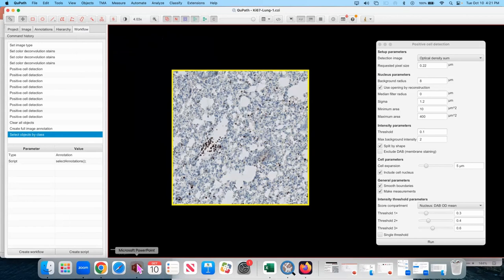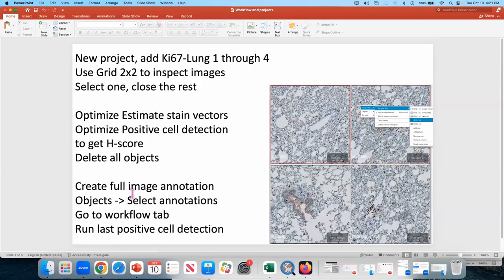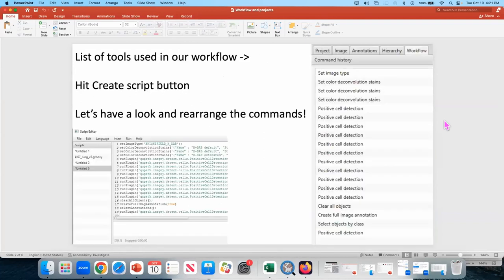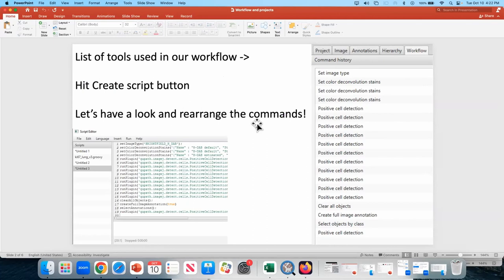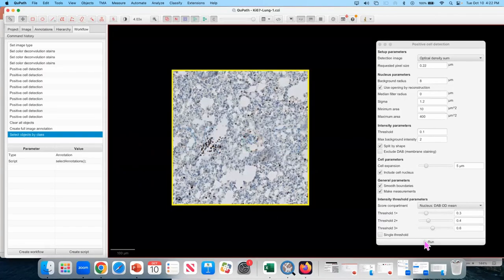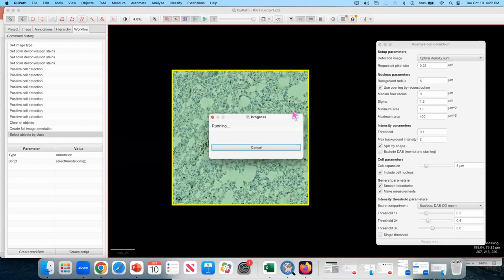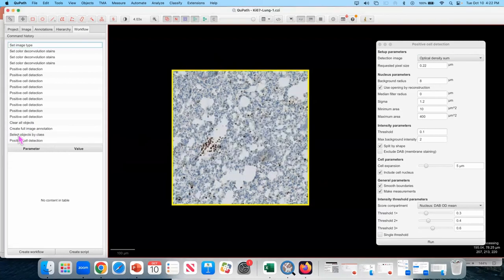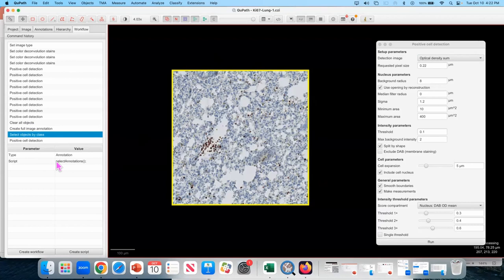And that's because I'm trying to create a list of tools that will be used in our workflow. And I'm going to tell you in a moment why this is important. But once you have done your run on the full image with the positive cell detection, you want to have the commands clear object, create full image annotation, and select object by class, and that script is select annotations. You want to hit create script.